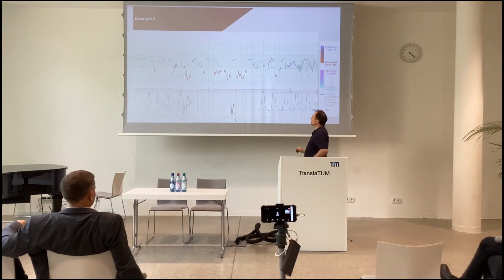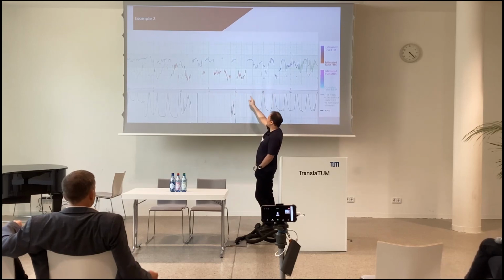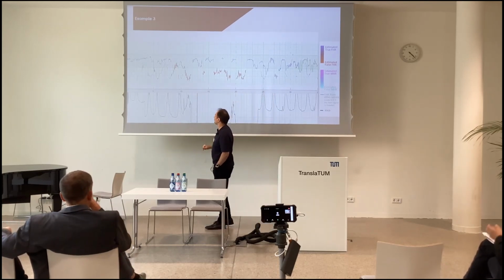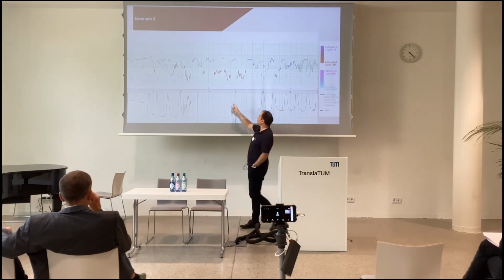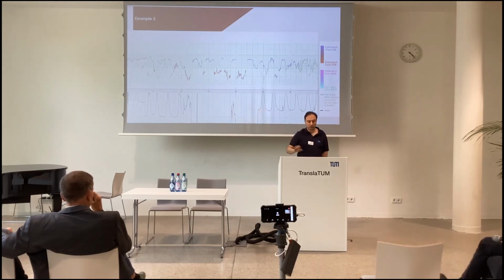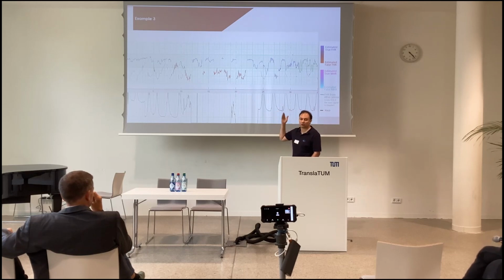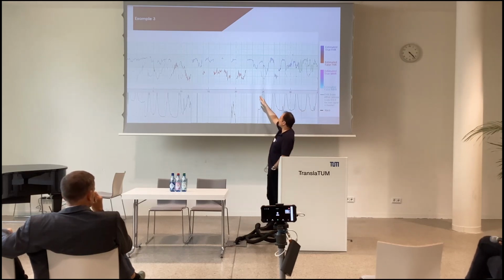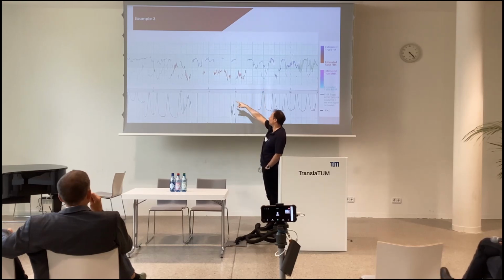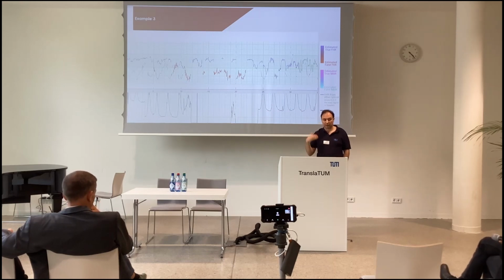This is another example. There is some small FHR deceleration, and there is also acceleration in the maternal heart rate. And for this period, there is no maternal heart rate, so we have to interpolate where the maternal heart rate is during this period. And I don't know if the method works like that, but we can see that the variability is not the same between the maternal heart rate and the fetal one. So maybe it's a clue that the method can use to make this recognition.